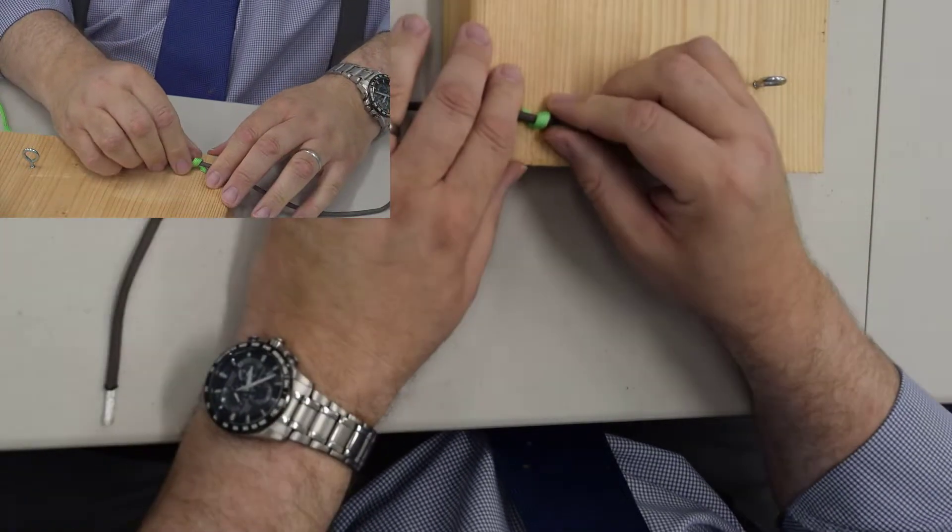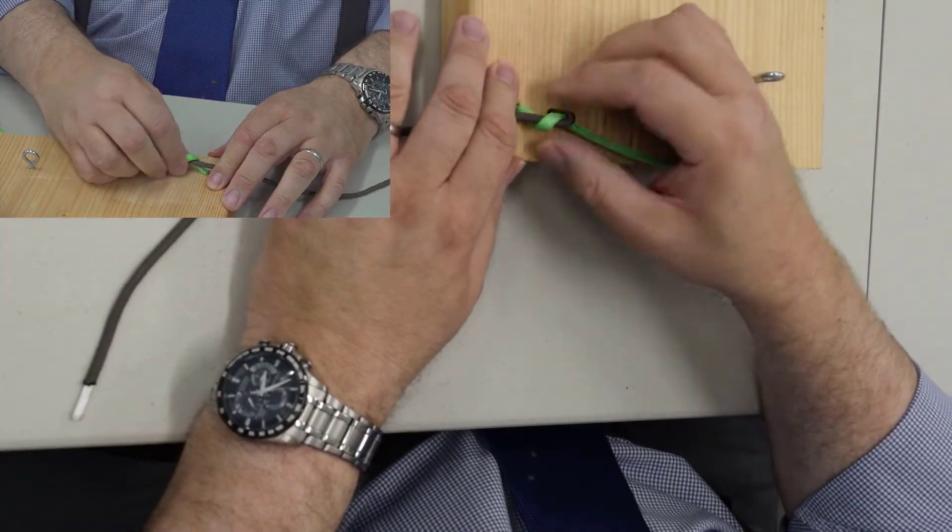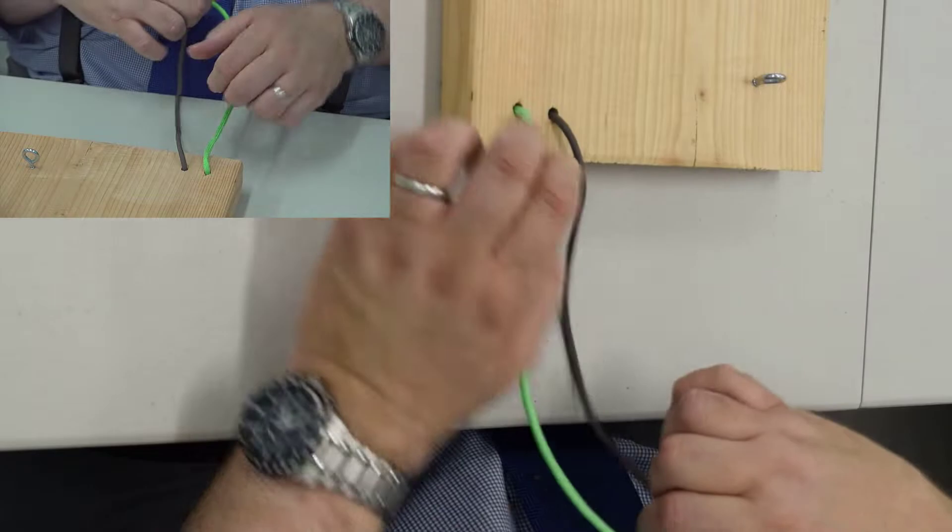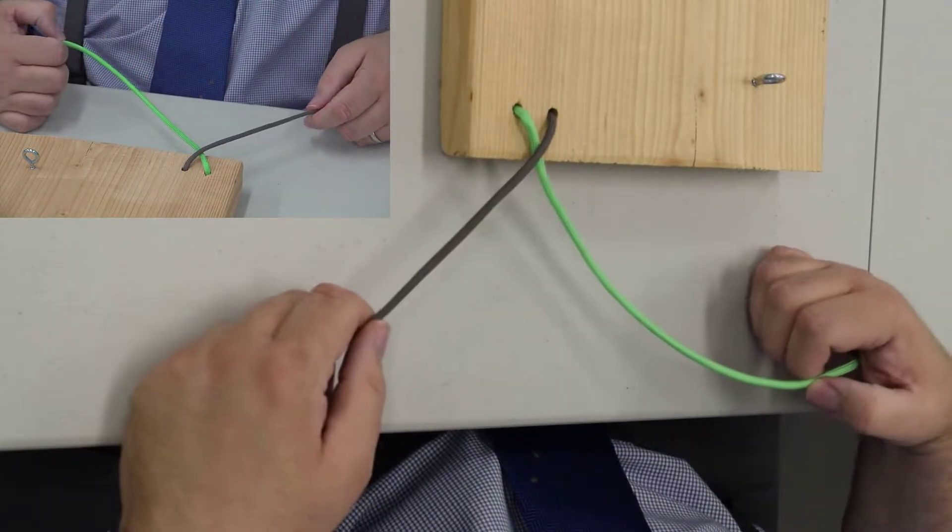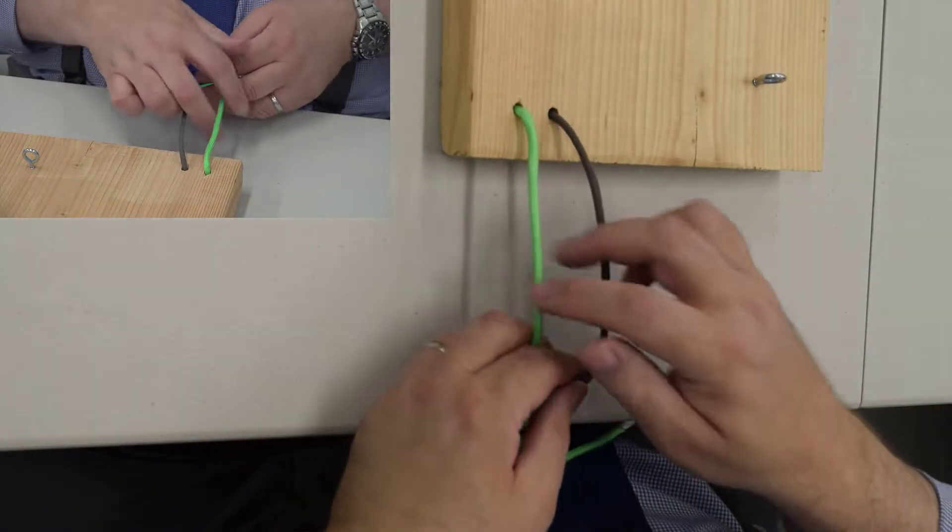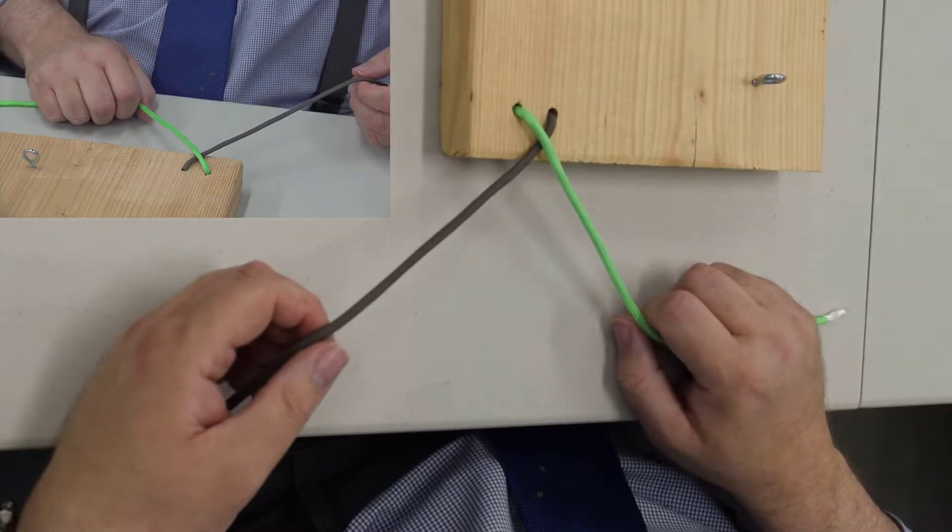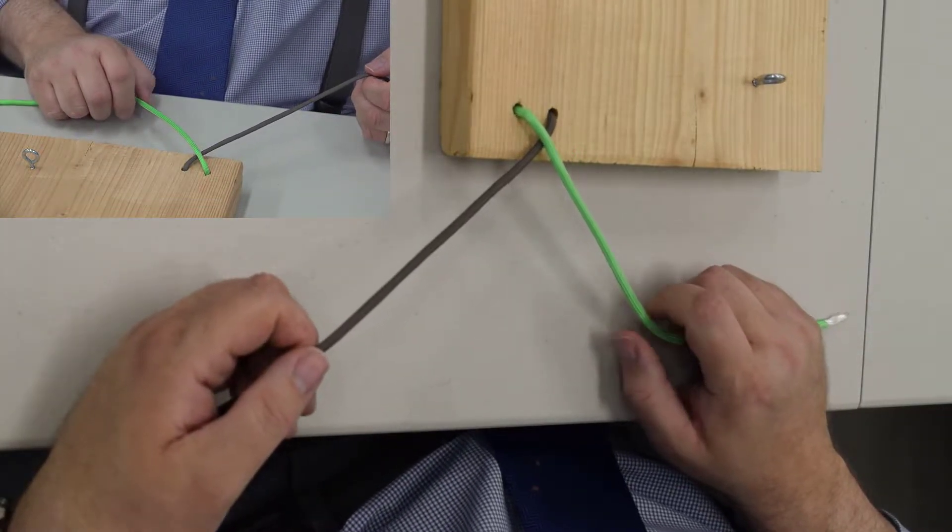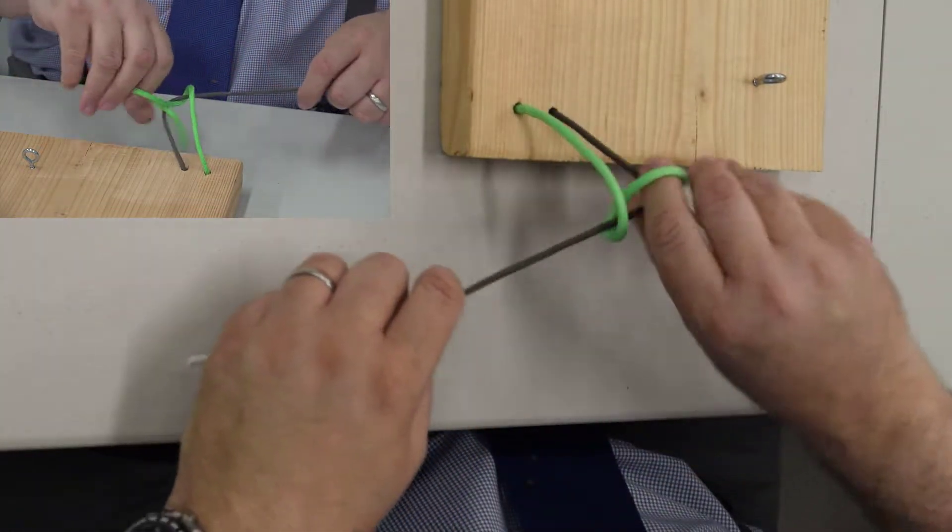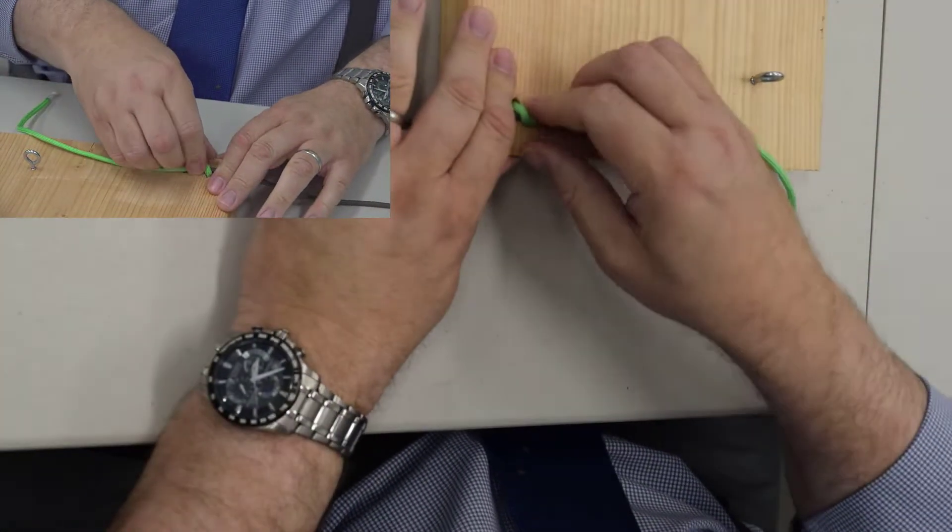So it does matter which one of your sutures is on top. It matters because it will determine what the first throw you make of the knot will be on the one-handed tie.